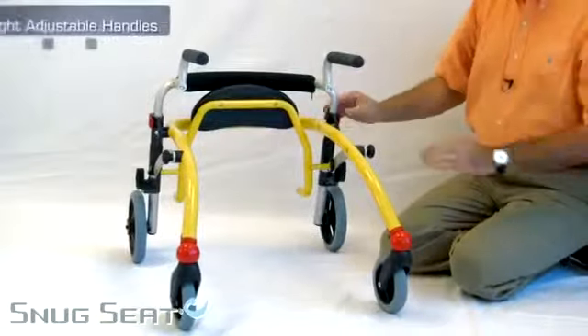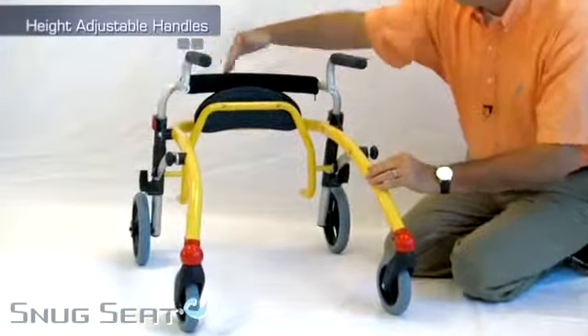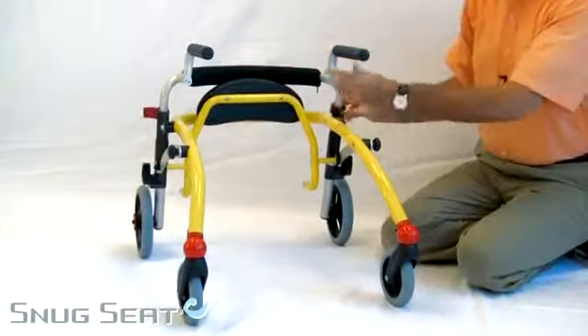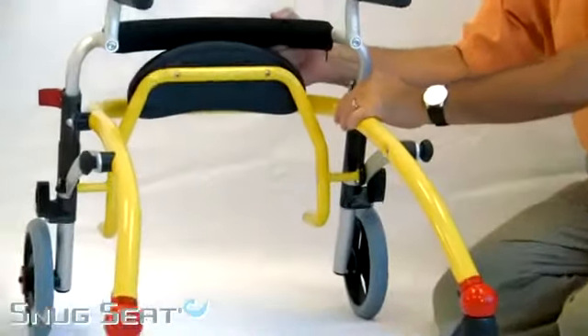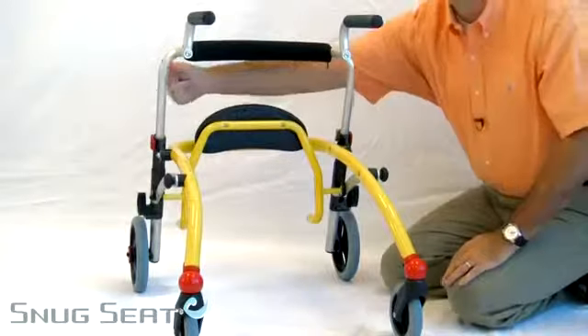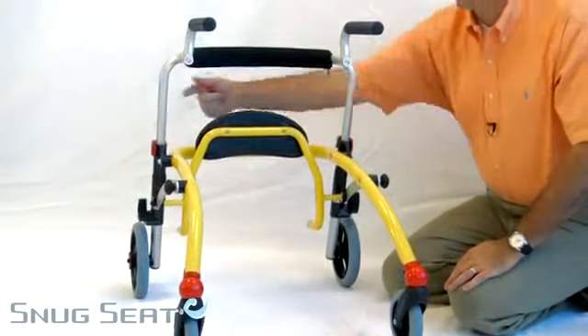The Crocodile also has adjustable height handles by unlocking the red lever and lifting the handle up. It is scored on either side for proper height.